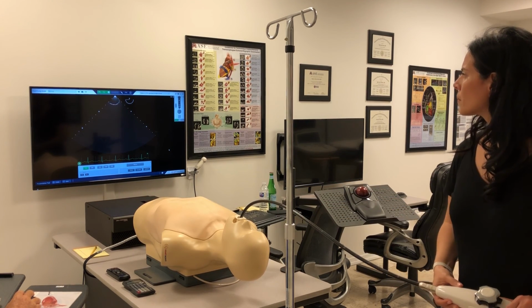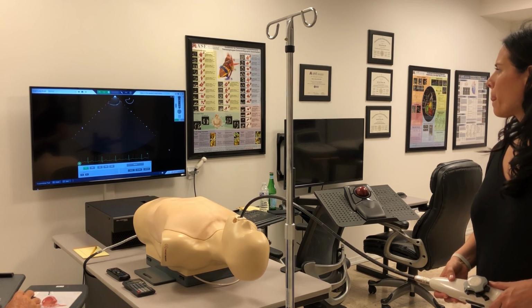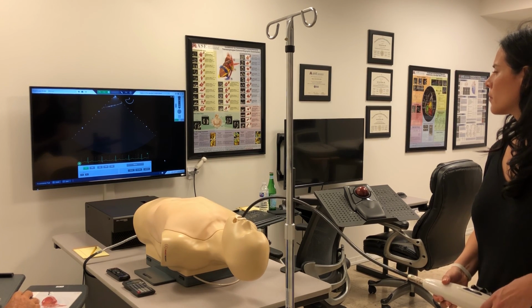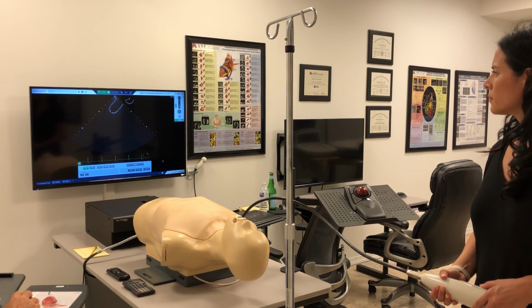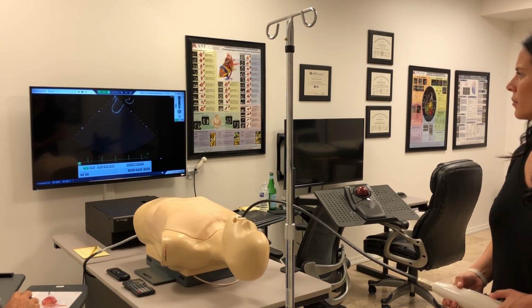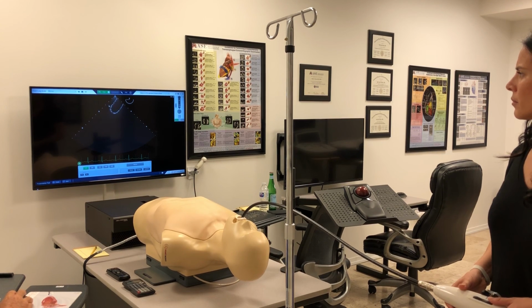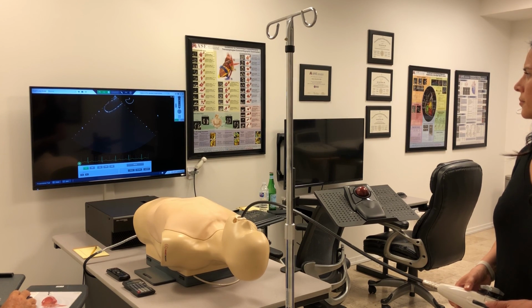And if you kept pulling here, you're very high in the esophagus, so you pull out of the upper esophageal sphincter. Here, you want to rotate the probe to illustrate the maximum amount of the aortic arch, just like that. That's the exact angle to illustrate the largest amount of arch that you can get on screen at one time. You might want to reduce this space here a little bit. Yes, nice. So this is one of the only two upper esophageal views. The full name of this view is upper esophageal aortic arch long axis, clearly a long axis view.